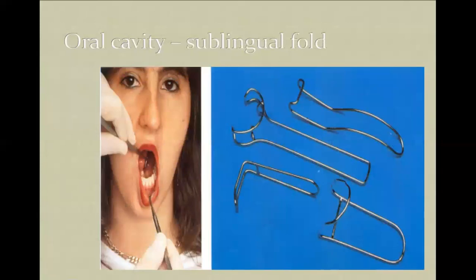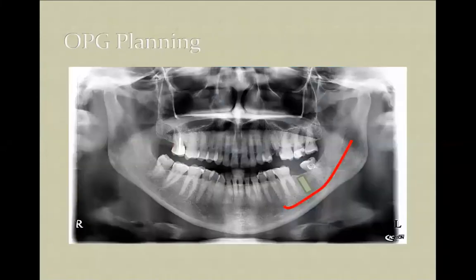Now, the radiological investigation we usually use in our clinical practice is, at minimum, an OPG. Frankly speaking, I've been working in this implant industry for the last maybe 15, 16 years. And I was trained at that time.